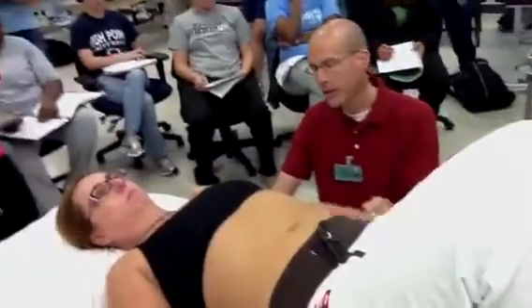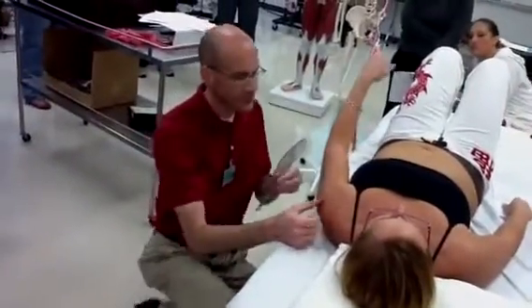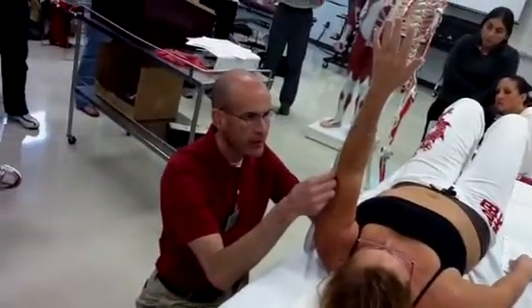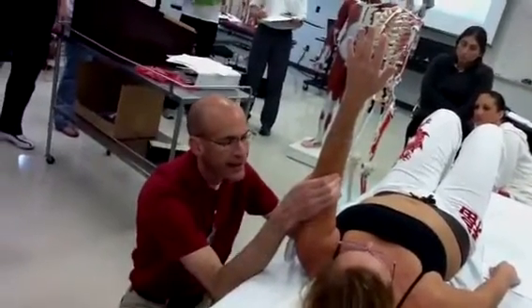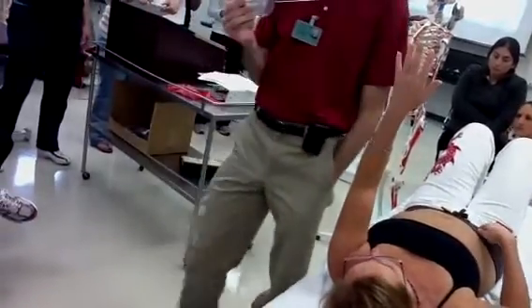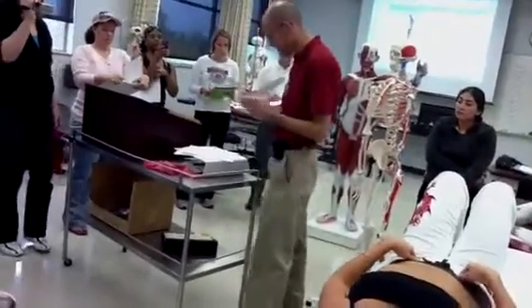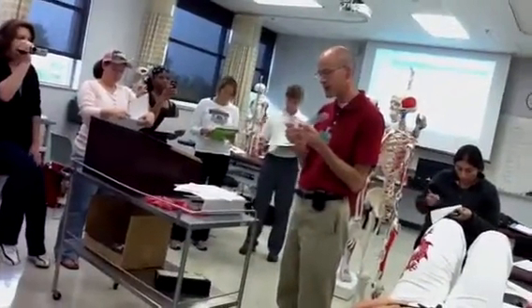So, okay, I found my landmarks. Greater tubercle. All right. Can you do that motion for me, please? As far as you can. And as far as you're able to go. All right. And I got a 97 there. That's about 95, right? So I'll just write down 95. No, right, 97. Write down 97. Okay. So that's number 8. Read and record the correct goniometric measurements.